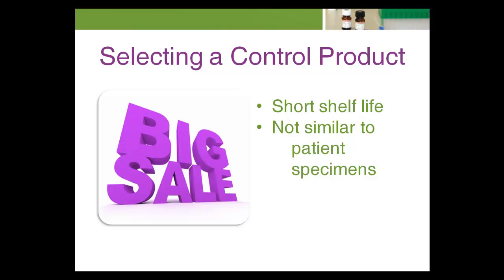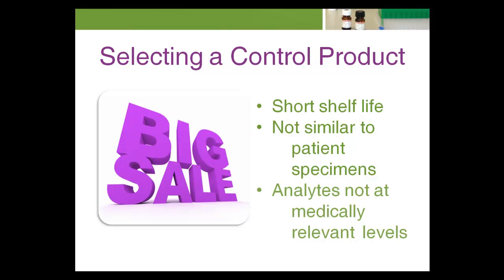Some inexpensive quality control products don't have all analytes at medically relevant decision levels. In some cases, laboratory administrators are misled by box pricing. This box pricing topic is described more thoroughly in this module.